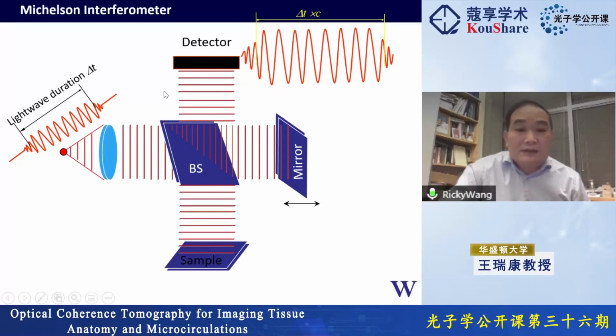Now, this system is set up, as I mentioned, using laser light, and the laser light has 1 kilometer of coherence length. Then you can put your reference mirror in this arm anywhere with a tolerance of 1 kilometer. However, if I switch this laser source into white light, for example, or using a strip light, we know that white light has a very low coherence length.